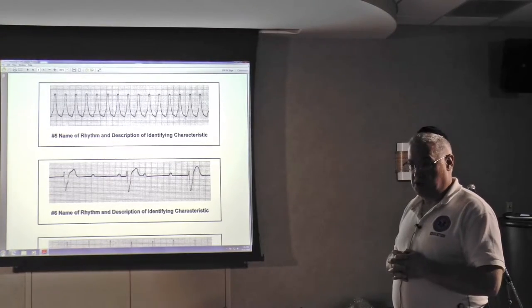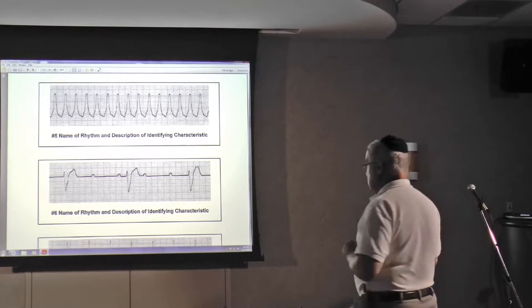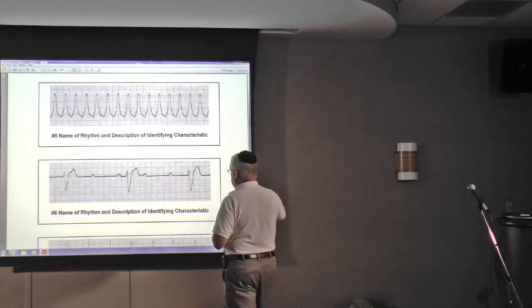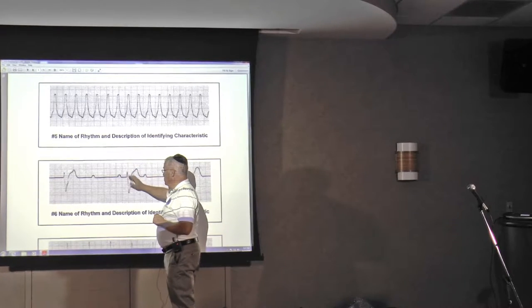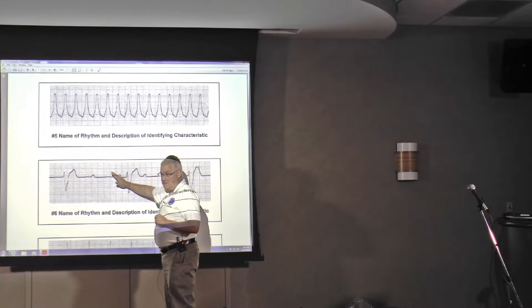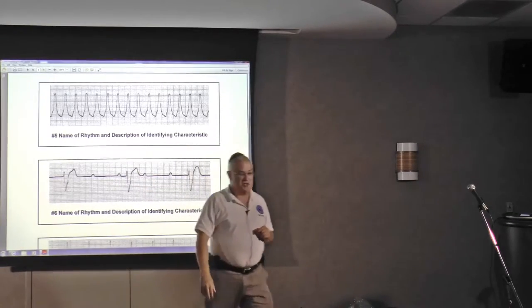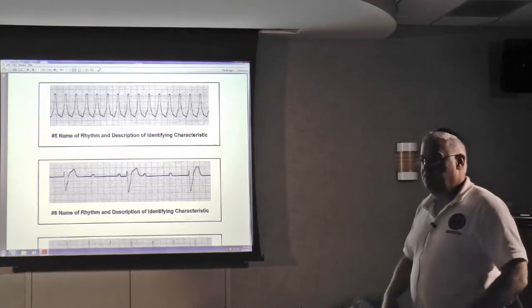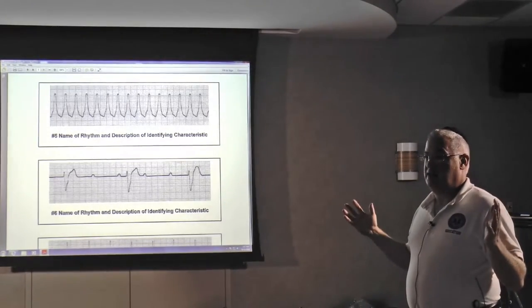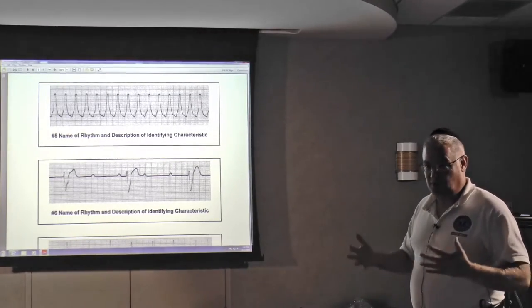So with cardioversion, the monitor looks for the highest point of the QRS and delivers the shock right after it. So it's in the absolute refractory phase of the heart, not the relative refractory phase. So it's considered a safer way of shocking someone. Why don't we do that in VFib? Because VFib's totally chaotic and the machine can't sync on anything. So you're just shocking. And there's no chance of throwing a patient into VFib that's already in VFib, so you don't have to worry about it.